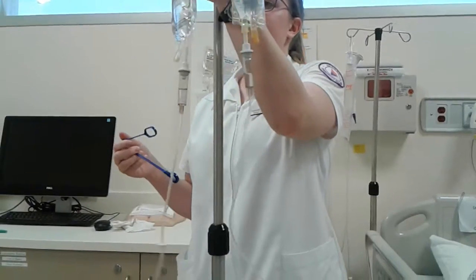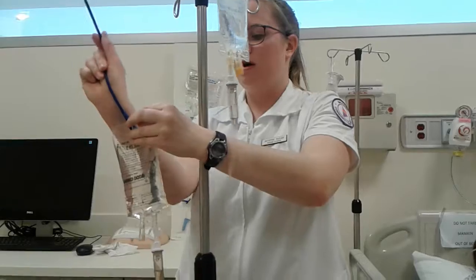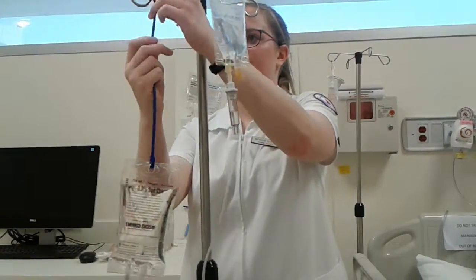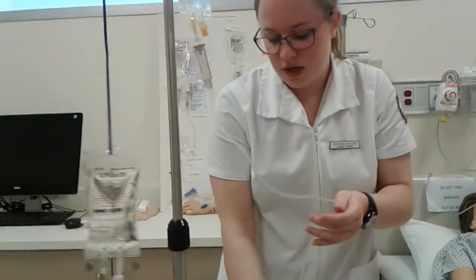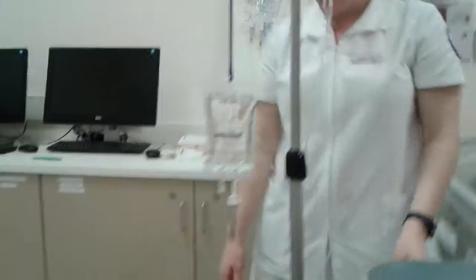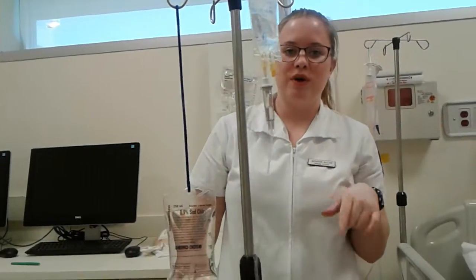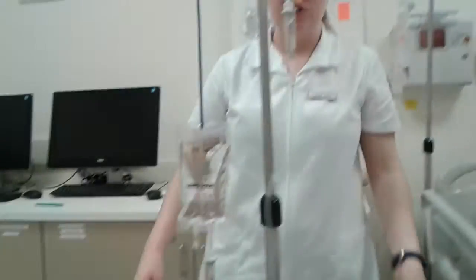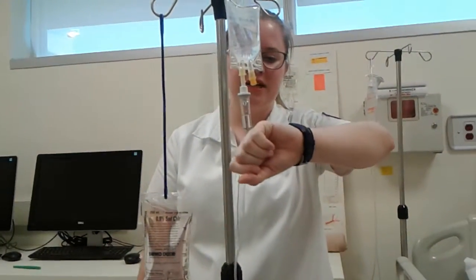I'm going to grab my extension and lower my primary. Next, I'm going to completely unclamp my piggyback tubing and control the piggyback medication with the primary IV tubing clamp. So this medication requires 1 drip every 3 seconds. So I'm going to go ahead and set up my drip factor.